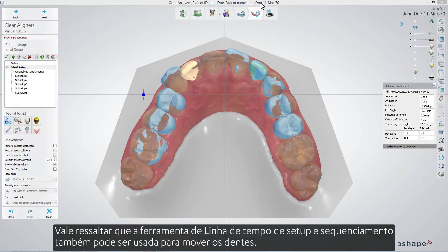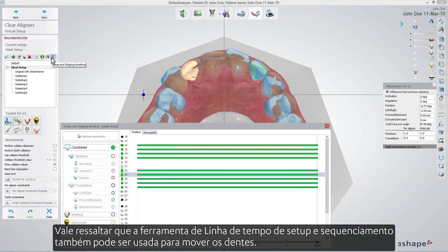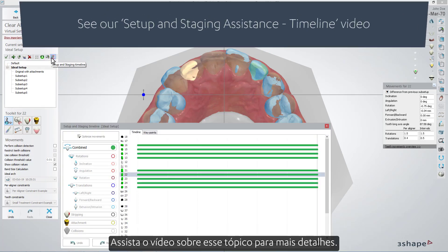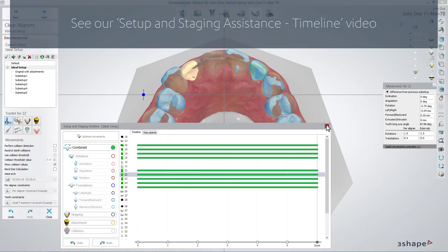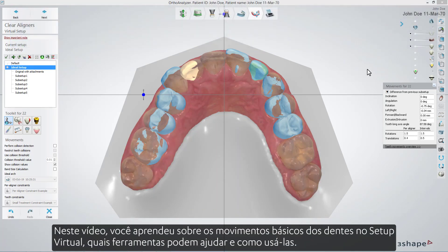It's worth noting that the Setup and Staging Timeline tool can also be used to move teeth. Please see the video on that topic for more details. In this video, you've learned about basic tooth movements in Virtual Setup, which tools could aid you with this, and how to use them.